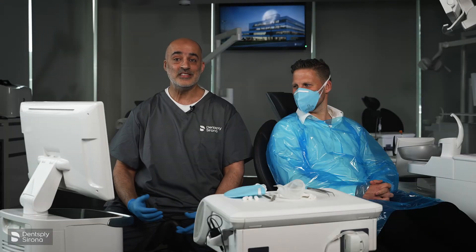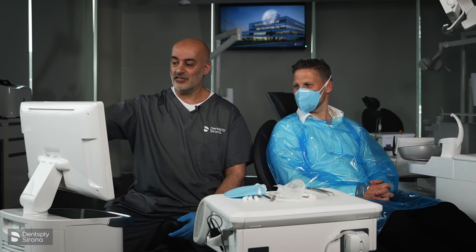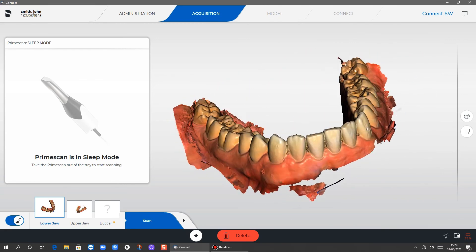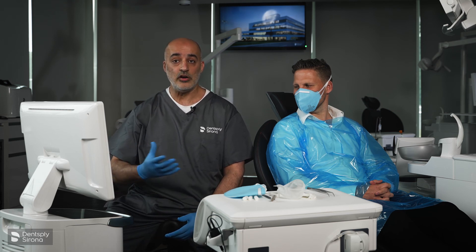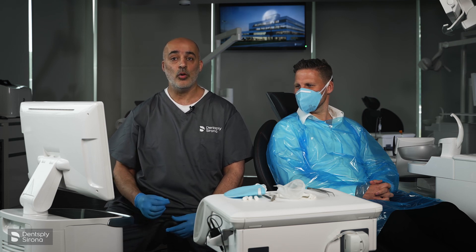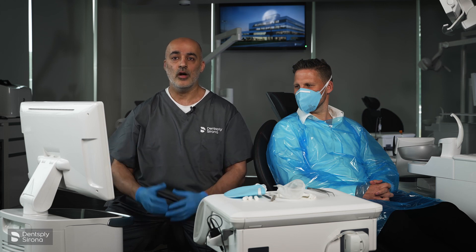We've now completed the scanning phase, and this still blows my mind — patients love it, you can show them their teeth and they're really engaged. The thought of taking another impression makes me shudder. On average, scanning an arch should take you a couple of minutes. Anything longer than that and you are over-scanning, increasing the file size and processing times, which slows down the whole process.